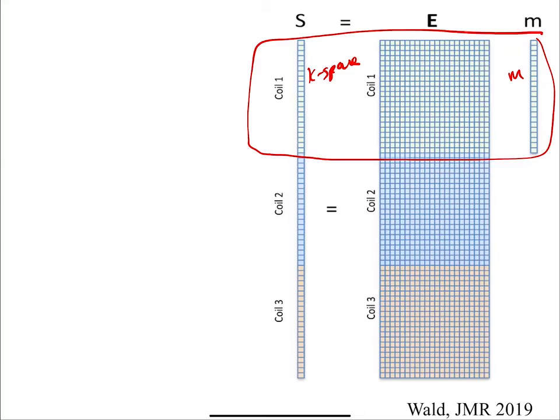It turns out that these components here in the matrix were basically Fourier components. So traditional MRI assumes that that matrix is the Fourier components, such that what we measure, the K-space, is just a Fourier transform of my object. Then if I want my object, I just say F equals F inverse, let's call this S. So that's traditional imaging.